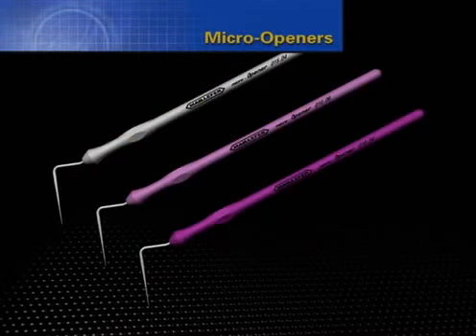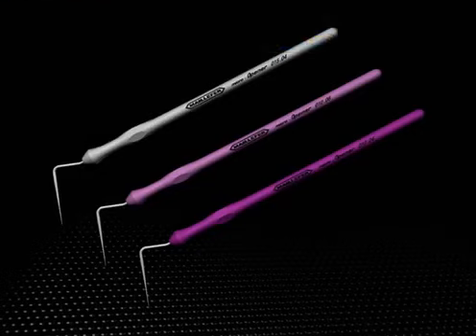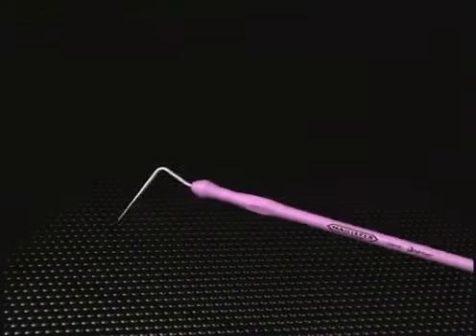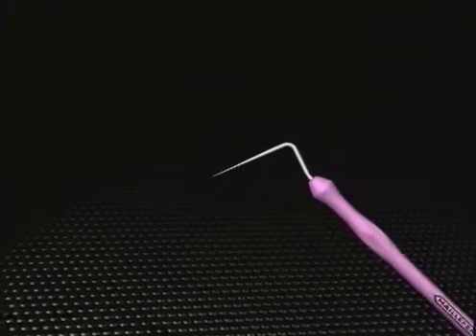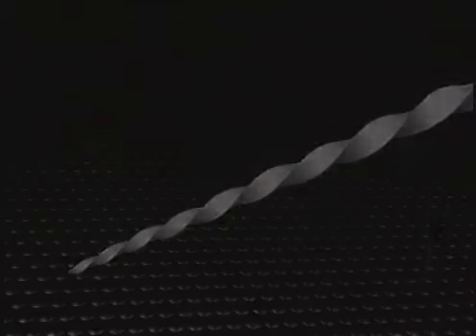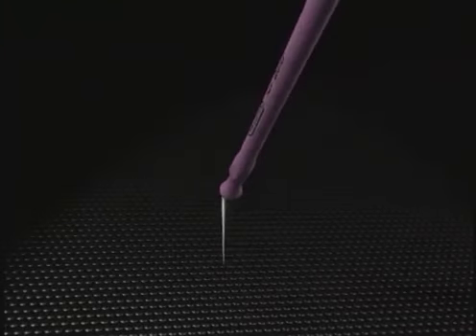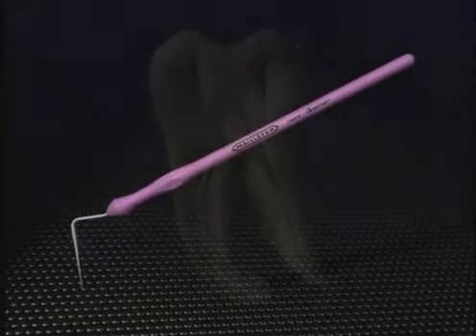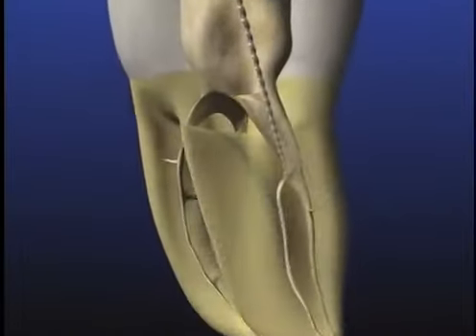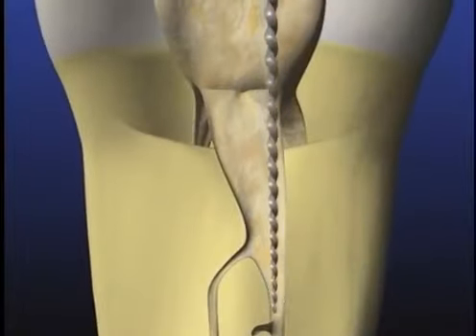Micro openers provide 3 instruments for initiating treatment in missed canals. Offset handles enhance vision, and 7 millimeters of cutting blades in conjunction with double and triple tapers enhance rigidity. Here's why I like the micro opener in the difficult to find canal case. Broad roots oftentimes hold more than one system. Oftentimes the division is far below the level of the orifice.